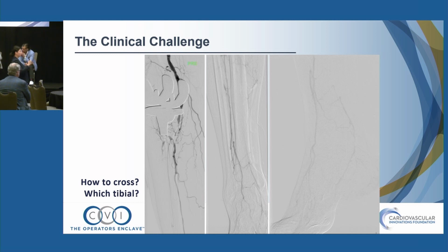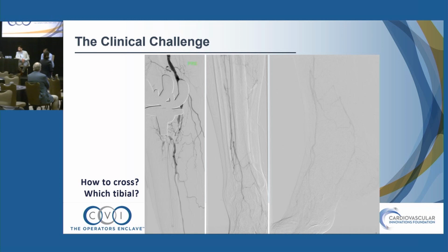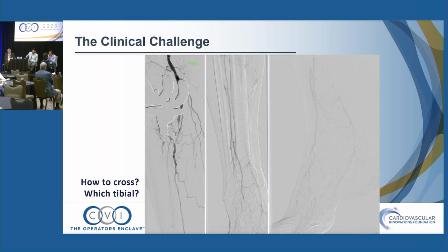So I'm going to turn to my panelists because I do only have one case, but we're trying to finish by 5 o'clock. All right, Ben, how would you approach this CTO? Don't say surgery. I would probably be coming antegrade from the right femoral artery.